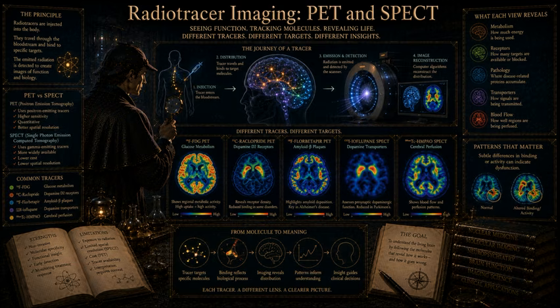However, when microglia, which are the resident macrophage immune cells of the central nervous system, become activated in response to injury, chronic stress, or active inflammation, they massively upregulate their cellular expression of TSPO. Therefore, using a radiotracer that tightly binds to TSPO allows us to essentially map activated microglia and quantify neuroinflammation in vivo. It is a heat map for brain inflammation. But the text mentioned a massive, completely unexpected genetic hurdle that researchers slammed into when they started using the second-generation TSPO tracers, like 11C-PBR28. Oh, it was a fascinating genetic bottleneck that nearly derailed the entire field.